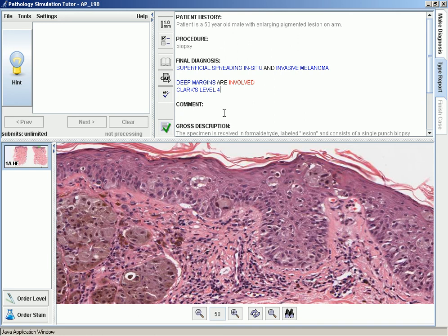There's also a spell checker to provide spelling suggestions. If you mistype something, as you see, I'll just mistype a word. And as you see, it gets underlined in red, kind of like how you would see in a regular word processor. So you can see what words are misspelled just by looking for the red underlining. Now if I right click on that term, as you can see, I get a bunch of spelling suggestions for that word. So you can spell check that way, just checking individual words by right clicking on the word.